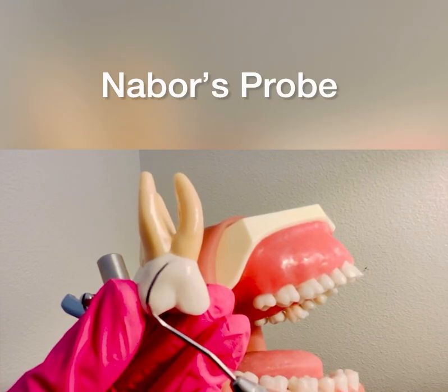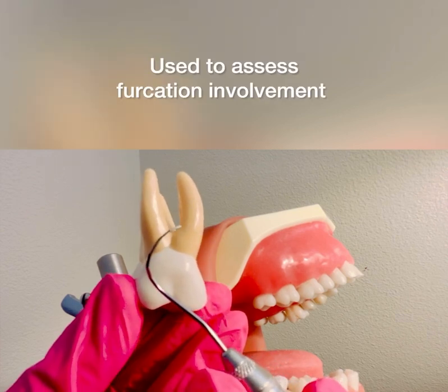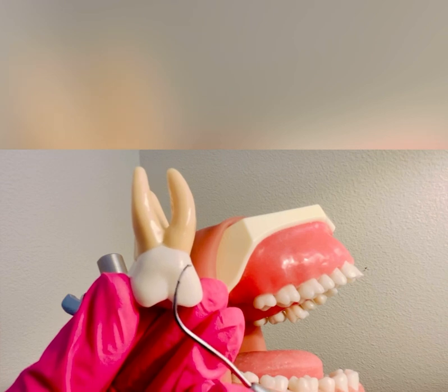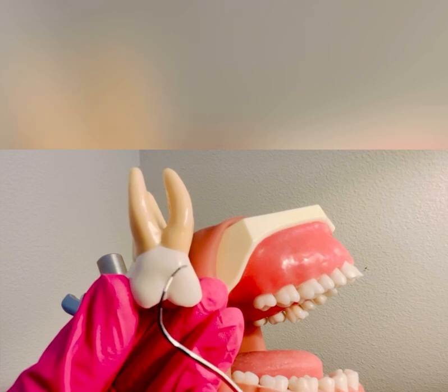Introducing the Nabers probe. This is an assessment instrument used to assess furcation involvement. As you can see, it has a curvature on the working ends and it is very similar to the Marquis probe, where it has the three millimeter markings.